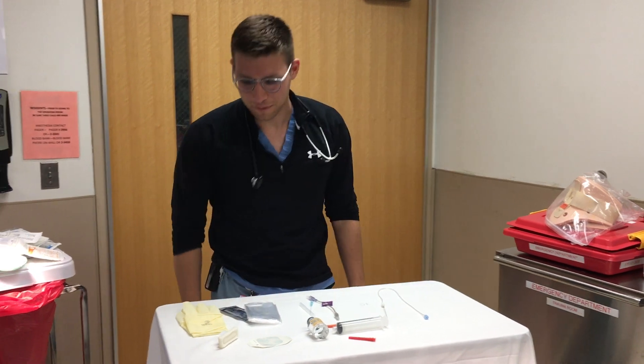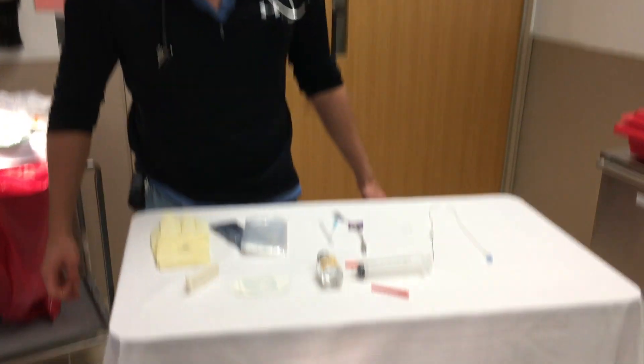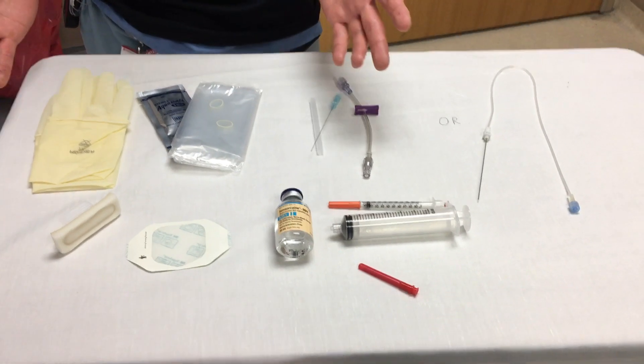Hi everyone, I'm Lex and we're going to be talking about how to do a fascia iliaca block today. I just want to quickly go over the setup here on the table. First things first, you want to basically have equipment to set up for a sterile field.